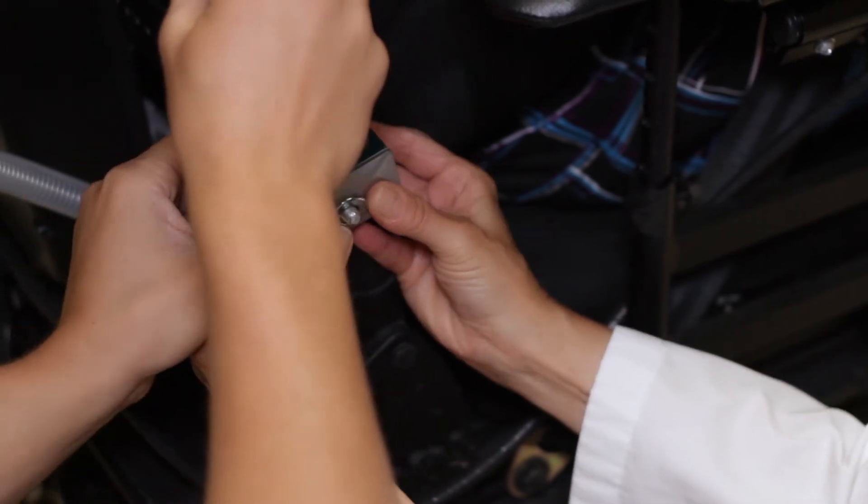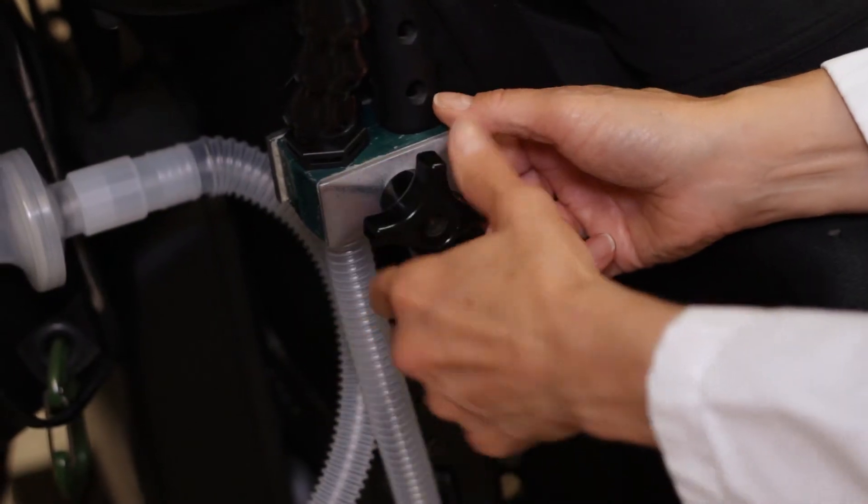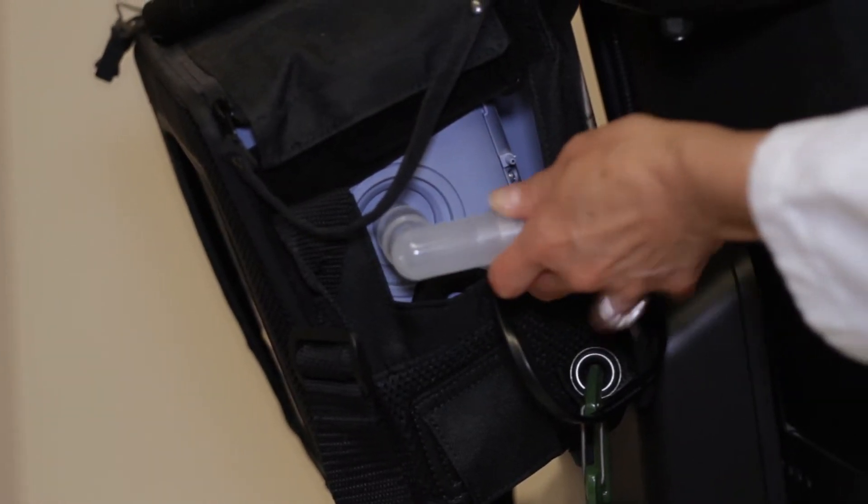Usually one of the wheelchair canes. Tighten the clamp to the cane with the CanVent arm and breathing tube in place.